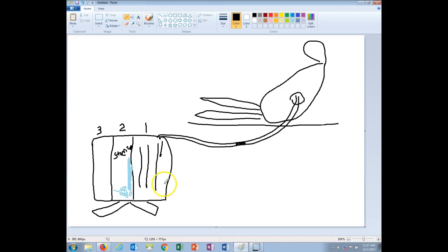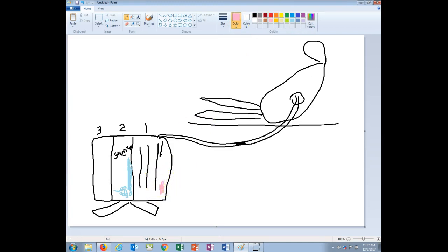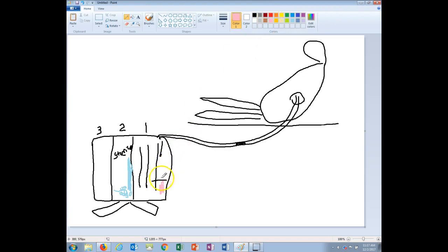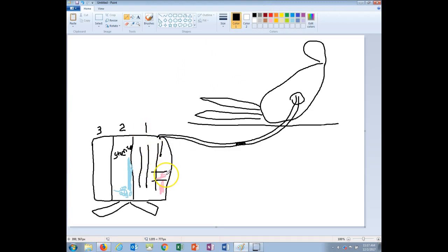So as you're checking on your patient, as there is drainage, let's say this is some drainage here, you come along, you will actually make a mark and you'll put a time and date to kind of keep track. As time goes by, say there's more fluid, you come by again, you put a line.